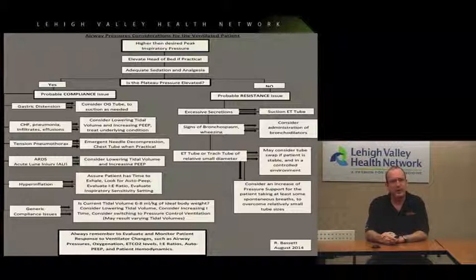Maybe not all trauma patients we can do that. Most neuro patients we can, especially if they're on the ventilator. Depending on the type of stroke, maybe we want to leave the head flat. Maybe if they're on hemodynamic support, we might want to leave the head of the bed flat. But especially with our more oversized patient, if they're flat, and they're a standard medical patient on the ventilator, or their C-spine's been pretty well cleared, they're not on a backboard, it's probably best we elevate the head of their bed.